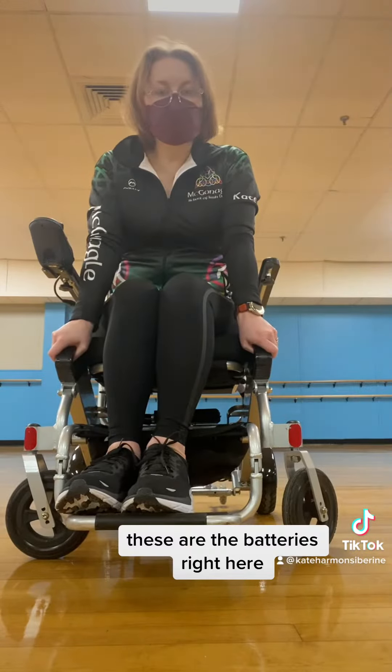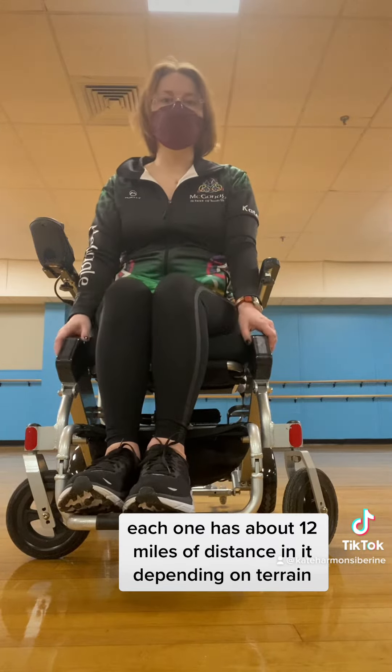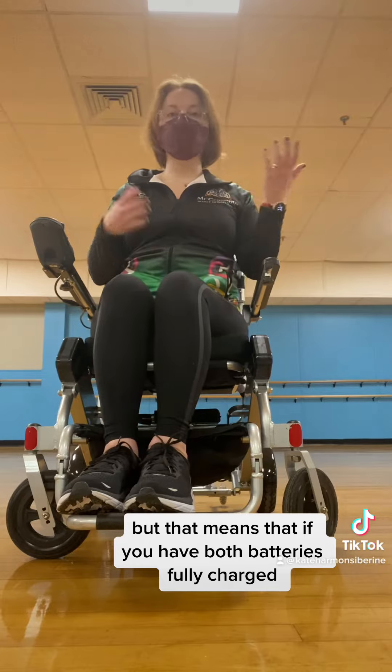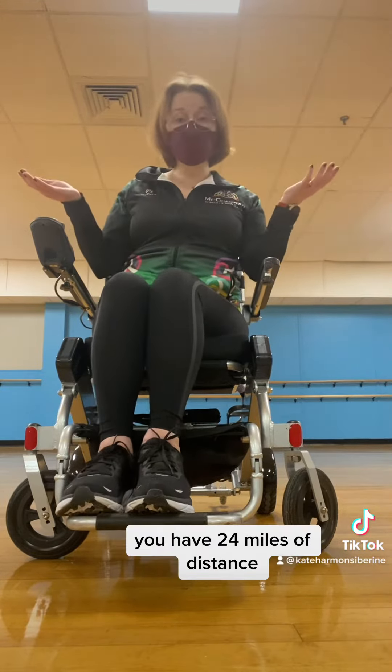These are the batteries right here. Each one has about 12 miles of distance in it, depending on terrain. That means that if you have both batteries fully charged — I charge them overnight — you have 24 miles of distance.